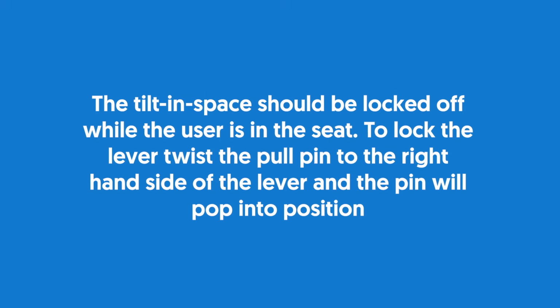To lock the lever, twist the pull pin to the right-hand side of the lever and the pin will pop into position.